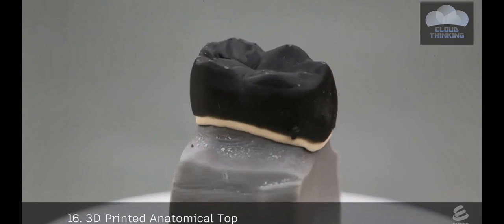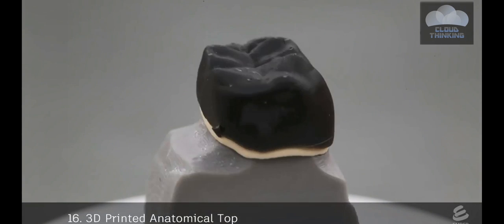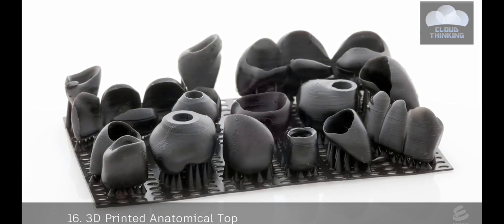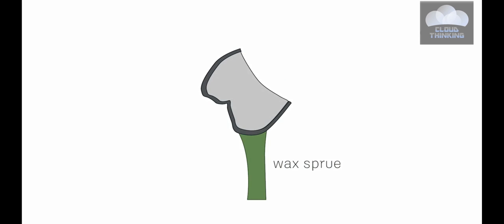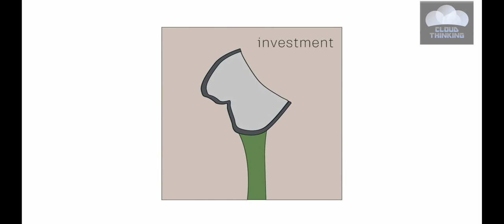To create the porcelain layer, an anatomical top is first 3D printed on Ember in castable resin. The top slides onto the opaque casting. The casting and top are then attached to a wax sprue. The part is surrounded again with liquid investment.